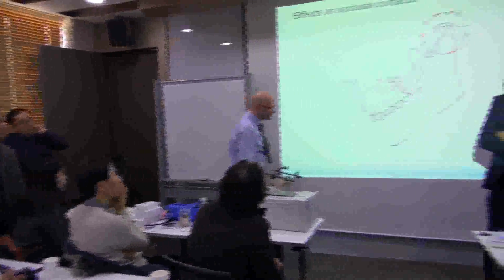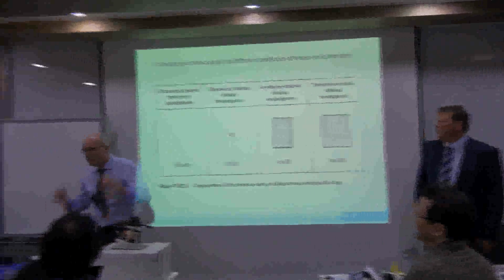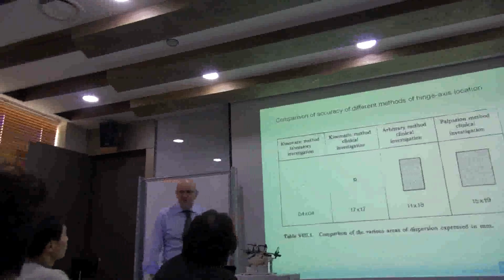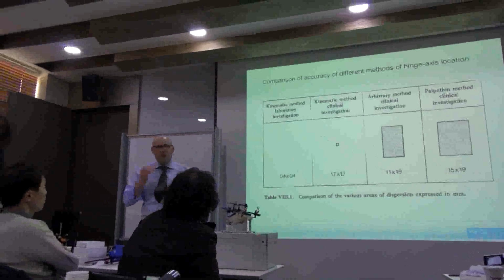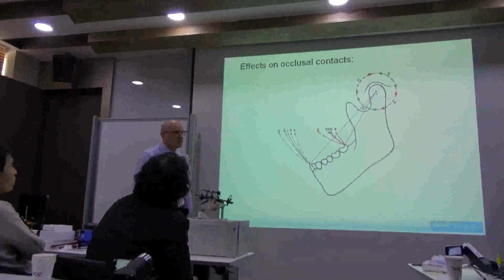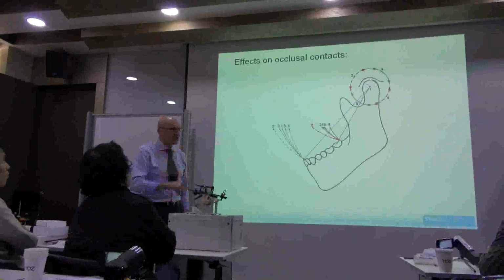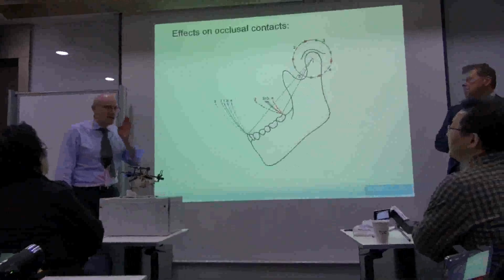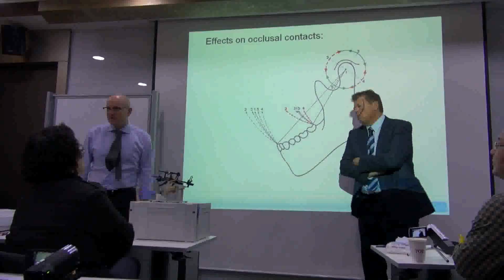Most important, go back one slide, please. Important thing. This value, 1.7 millimeters exactness, is acceptable. There is other research that says about 3 millimeters away makes an occlusion error, like in the next picture, of 0.1 millimeter. 0.1 millimeter in a crown is too much. We have to grind. So if you want a precise occlusal surface from the lab, you need to have the true hinge axis below around 1.7. You can only get this with this mechanical method.